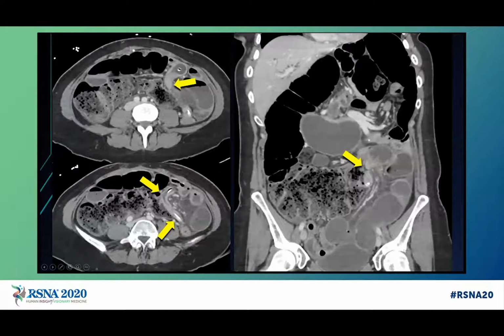This is a more complex patient with twisting of the small bowel causing small and large bowel obstruction. In this case, the axis of rotation is the patient's jejunostomy tube, around which the colon and small bowel rotated and caused this complex obstruction due to the indwelling tube.